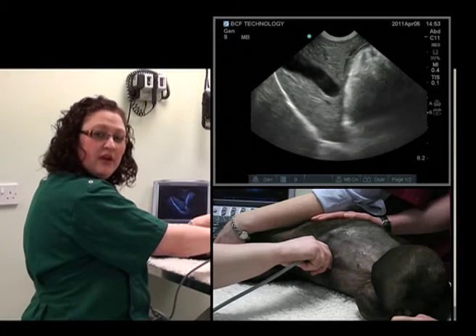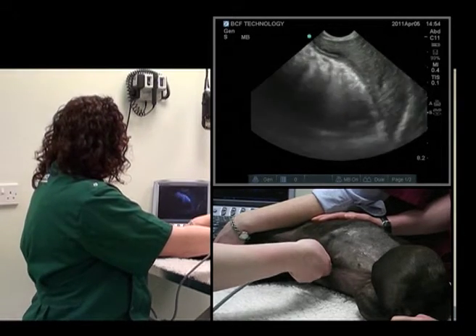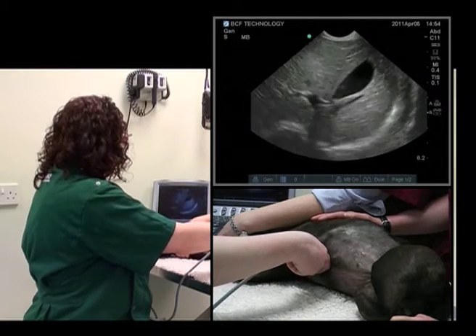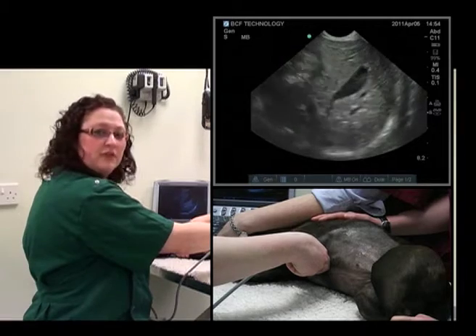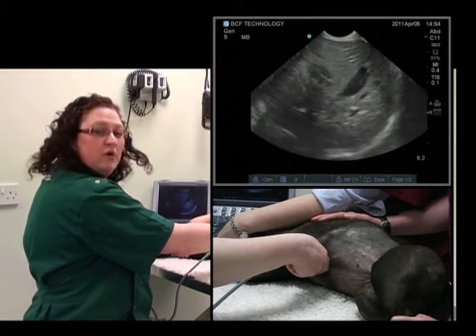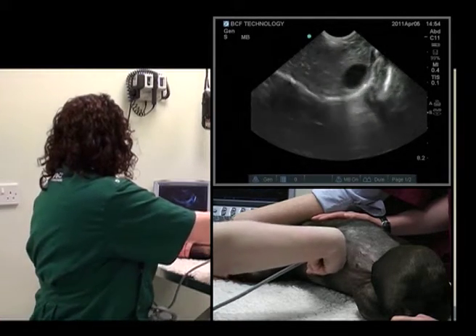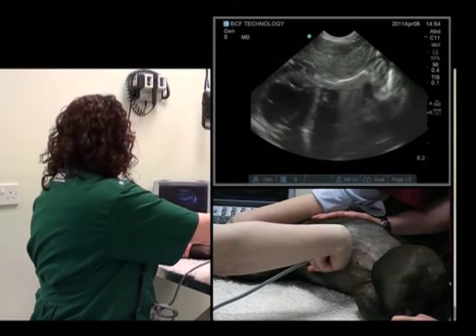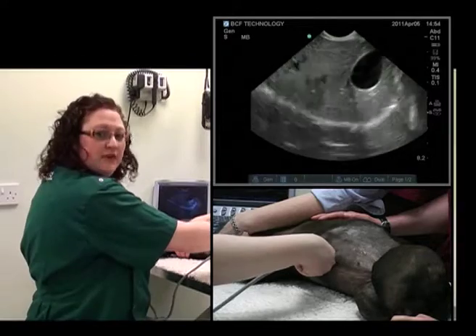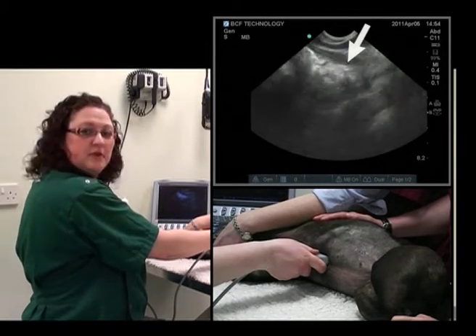What we'll now do is rotate 90 degrees clockwise. There we have the gallbladder and the liver on the screen. We'll want to fan cranially, and the heart comes into view. Then we fan caudally, and the stomach comes into view.